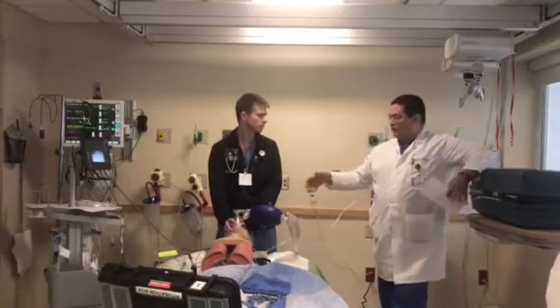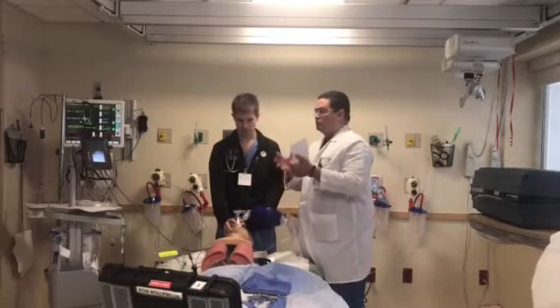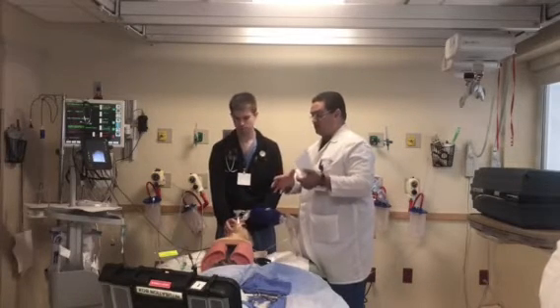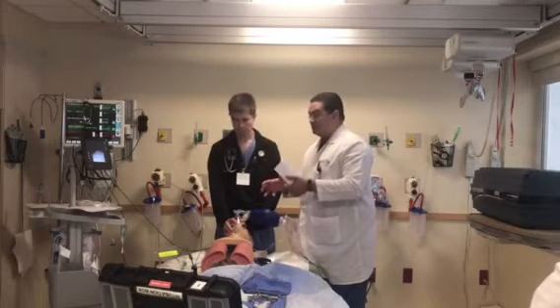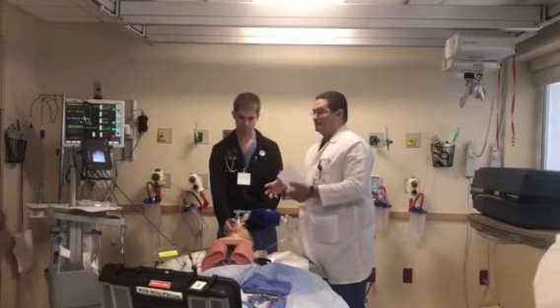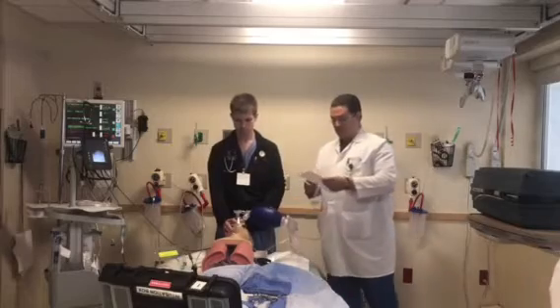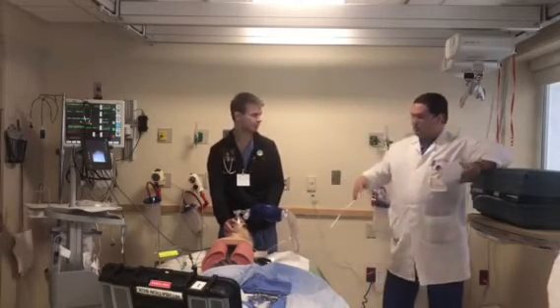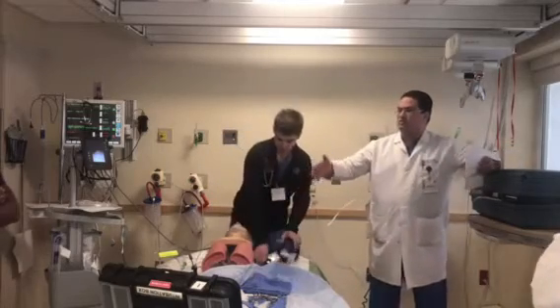The glide scope. Because now we proved that if all of us together hold that mask, we can get two breaths inside of him. Two breaths of 100% oxygen filling up the lung is enough to play for five minutes. But just get the two breaths in. That's very important. I missed that step all the time when I was young. So now I learned my lesson, right? You have to hold it nicely, get some breaths in, and then give him time to play. All right, so get the glide scope. We already did that step, so we're not going to repeat it again. The patient is now better, so we're going to use the glide scope.